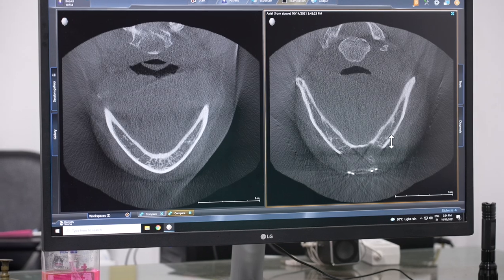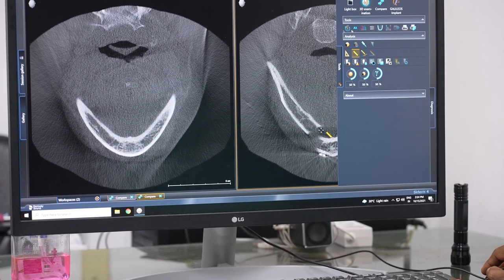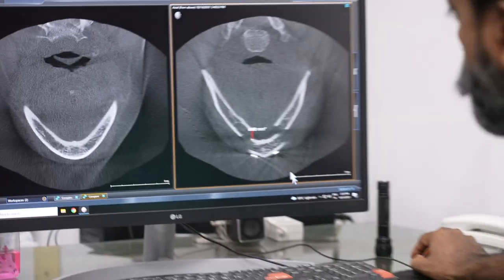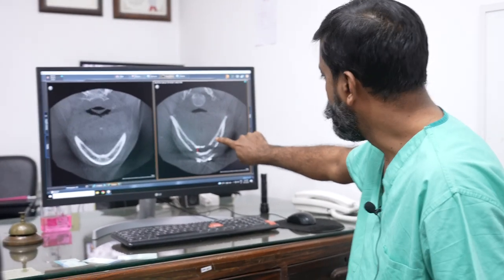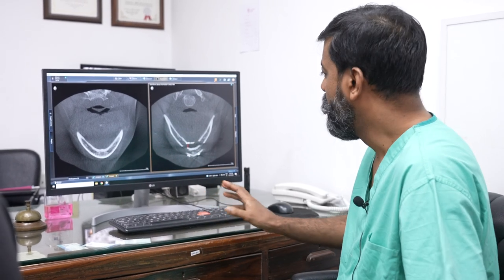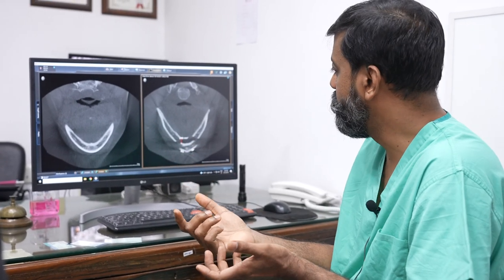So those are the screws and this is the cut. If you see, this is one continuous bone. Very easily you can understand — this piece has come here, this piece has come here, this piece has come here. What is the distance between the two pieces? 8.8. We said 8 to 9, it's 8.8. A little variation can happen because it's a curvilinear one, so if I measure here maybe it will be 9.